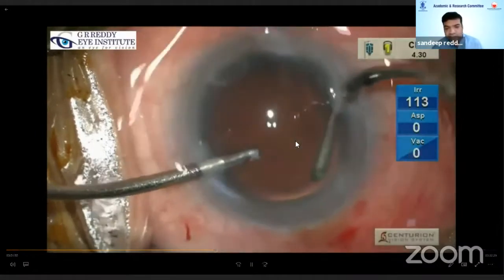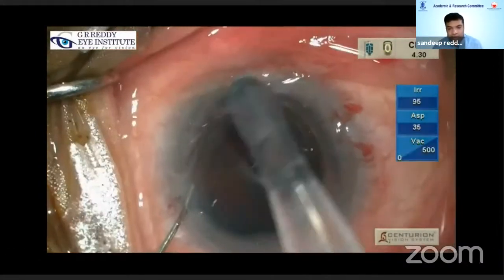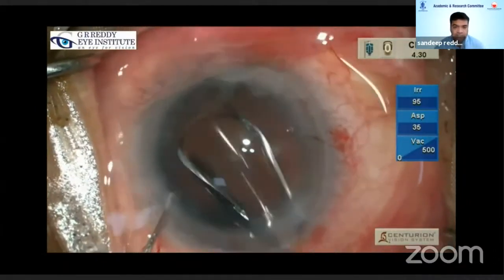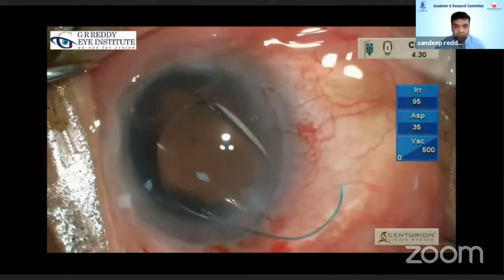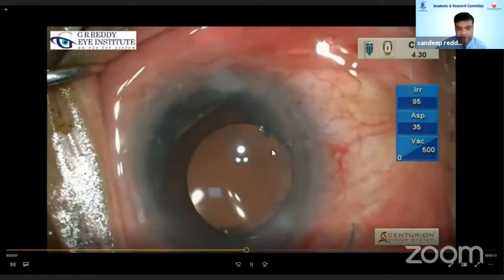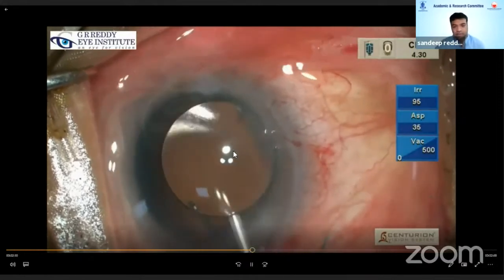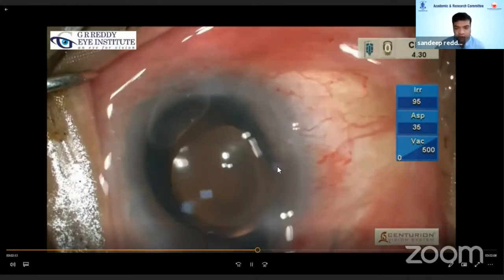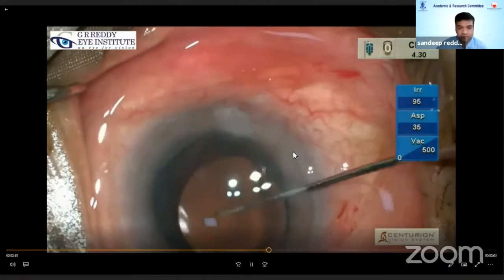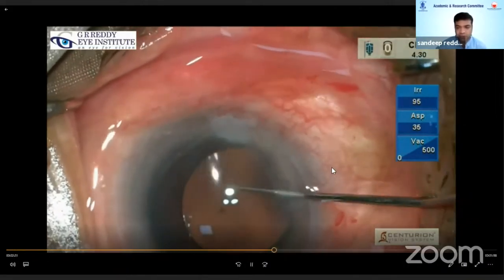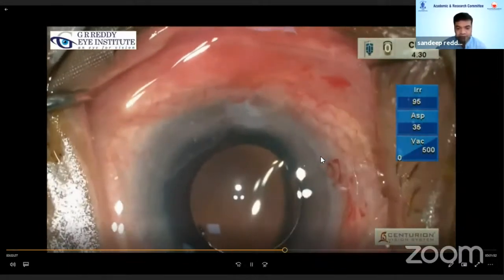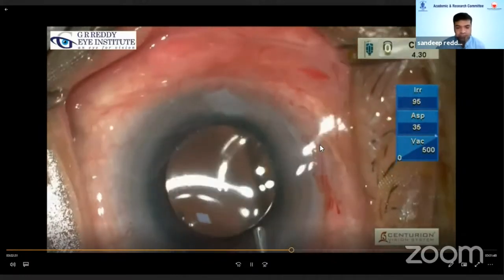This is one more instance where I finished the entire surgery and was doing an anterior capsular polishing, about to put in the IOL under the viscoelastic. When I was putting in the IOL, it got stuck in the port and there was a sudden increase in positive pressure. I injected some viscoelastic to form the chamber, but still I could not move the IOL. I tried loosening the speculum to reduce positive pressure on the eyeball, but still could not make any movement — the lens would not go into the bag at all.